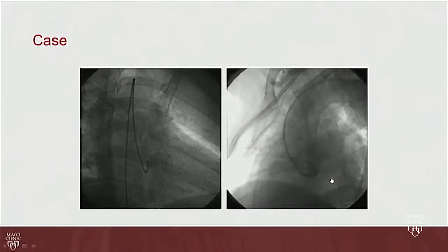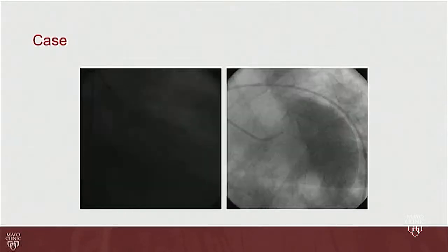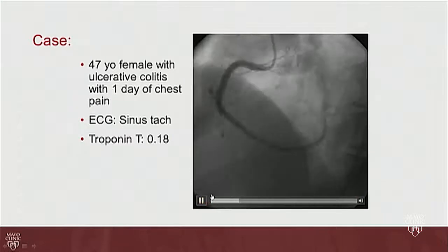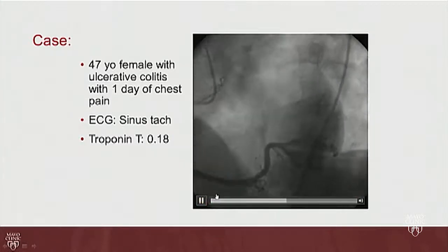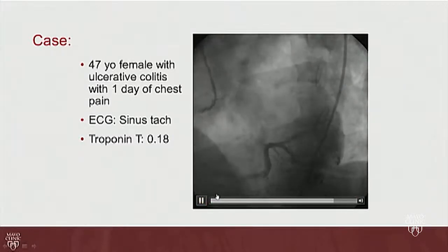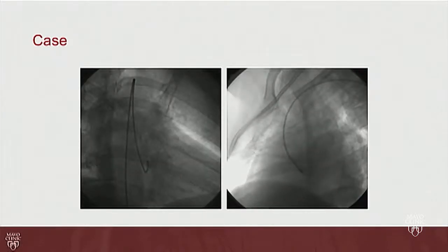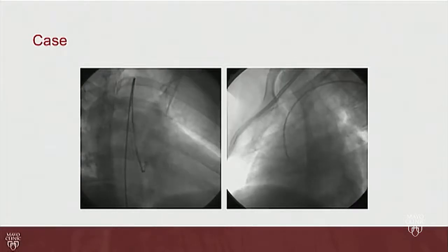Sorry, hang on, I'm missing my rights here. Up at the beginning. And there's the right coronary artery. You can see it's a large right coronary artery. And those were the lefts. And so I did a root shot looking to see if we could see another takeoff of a vessel, which I could not.